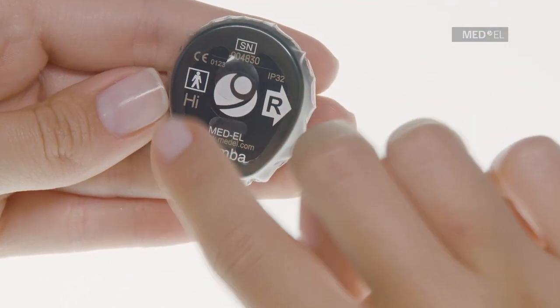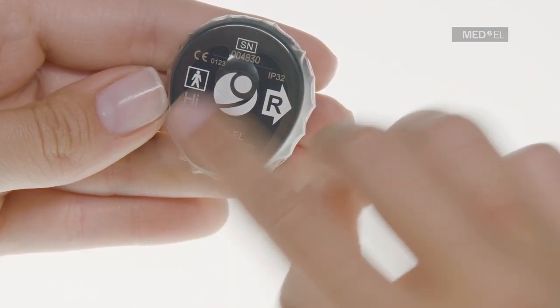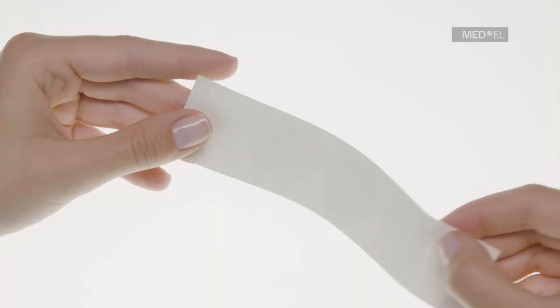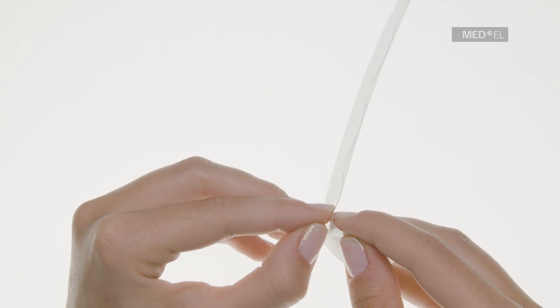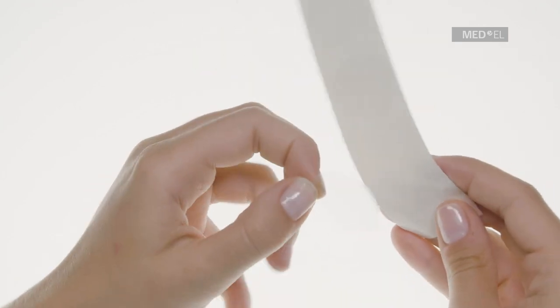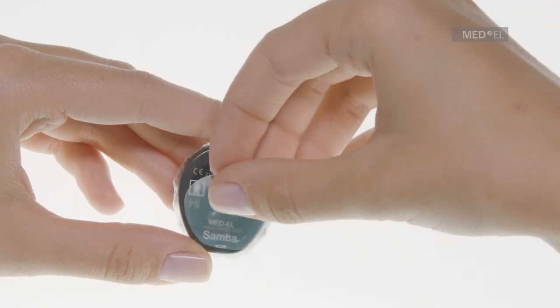The adhesive seal tapes are used to cover the opening of the skin. Make sure that all components are clean and dry before you attach the adhesive seal tape. Remove the adhesive seal tape from the protective cardboard.